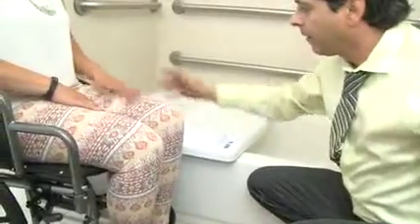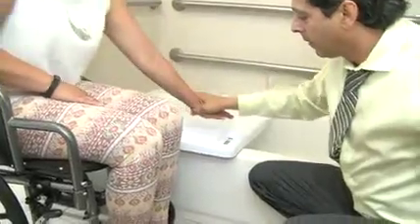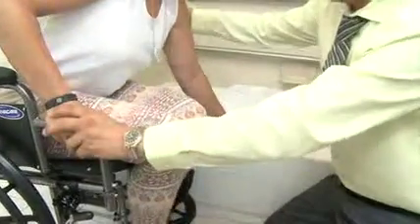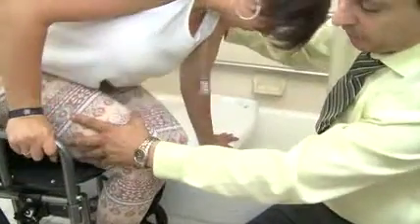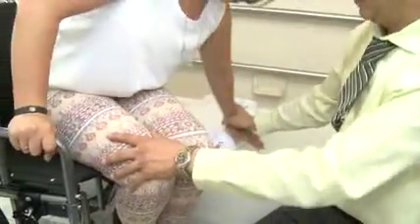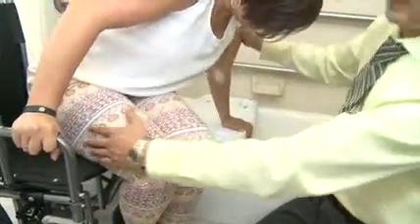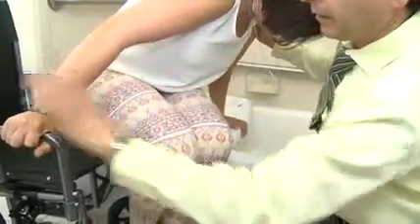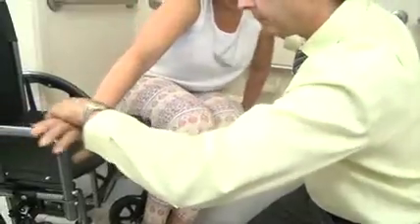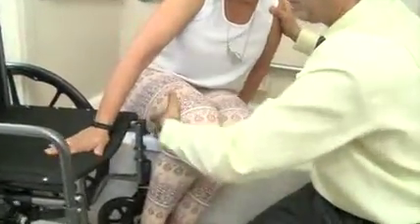Step 2. Instruct the individual to reach toward the bathing board with their hand closest to the tub, palm down on the seat. Their other hand remains on the wheelchair armrest. Instruct and assist them to lift their body carefully and scoot from the wheelchair seat onto the bathing board seat. This may take a few attempts, and their legs should still be outside the tub while scooting.